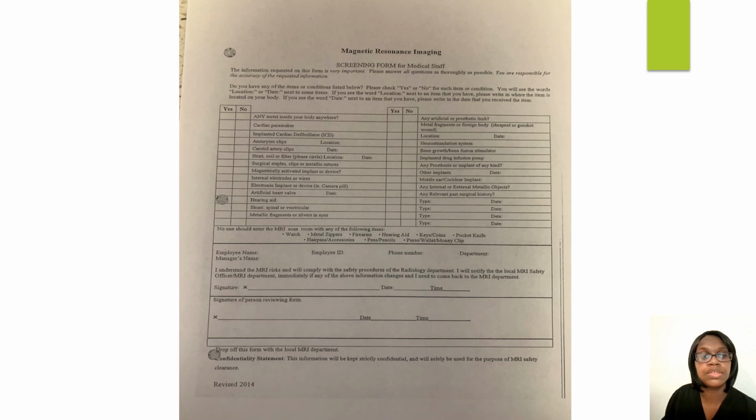It will tell them to fill out this information, yes or no. It will also tell them what needs to be removed. It will have their employee name, employee ID, phone number, department, and their manager's name listed. They must sign their name, and you need to sign it too. And just keep it inside of an MRI binder inside of the MRI tech area.